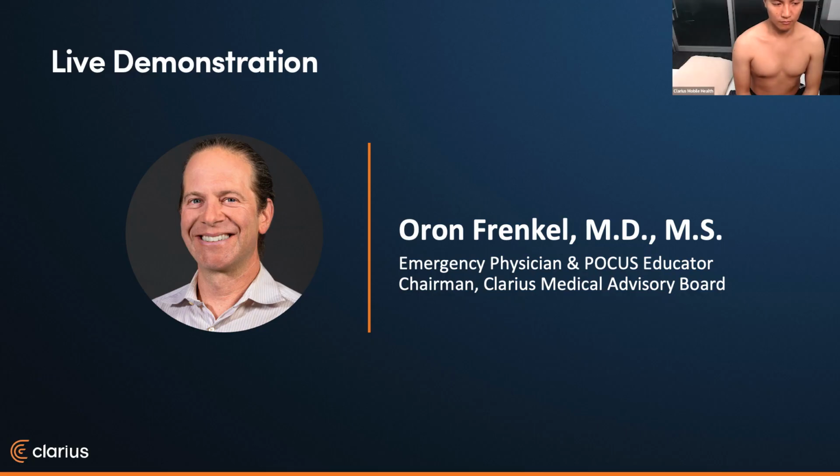Thanks so much, Mark. We're going to do a quick demo, but before I get to that, please use the Q&A. Make sure you give Mark all of your excellent questions. I know there's a lot more out there to come, and we will get to those before the top of the hour. And then I wanted to just do a quick demo on what this looks like for me, and maybe you can help talk me through it, Mark. I am certainly not an expert at shoulder musculoskeletal ultrasound like you are.